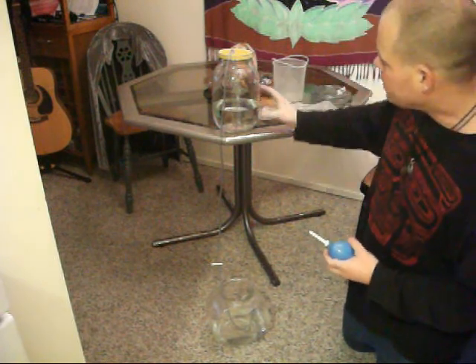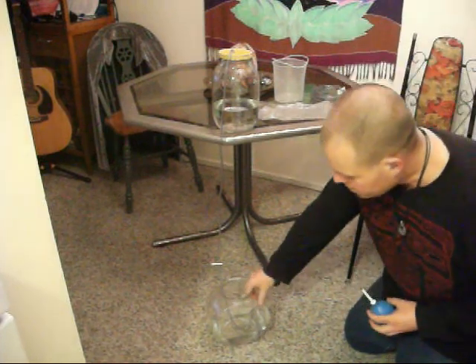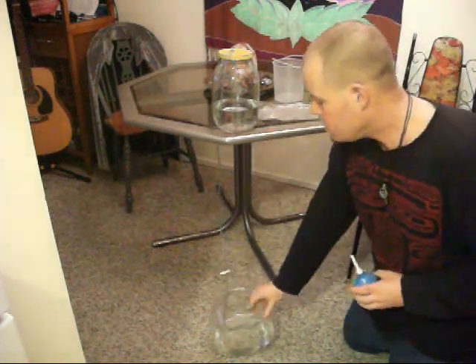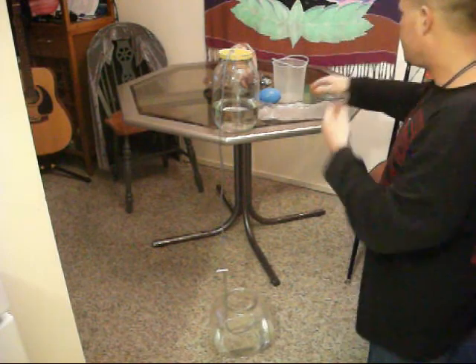There are these big glass jars here, like mason jars, which are about 4 liters, or these right here. These are the fish tanks, like 4 liters as well. So it's a siphoning principle here. All right, so I'll show you the first option.